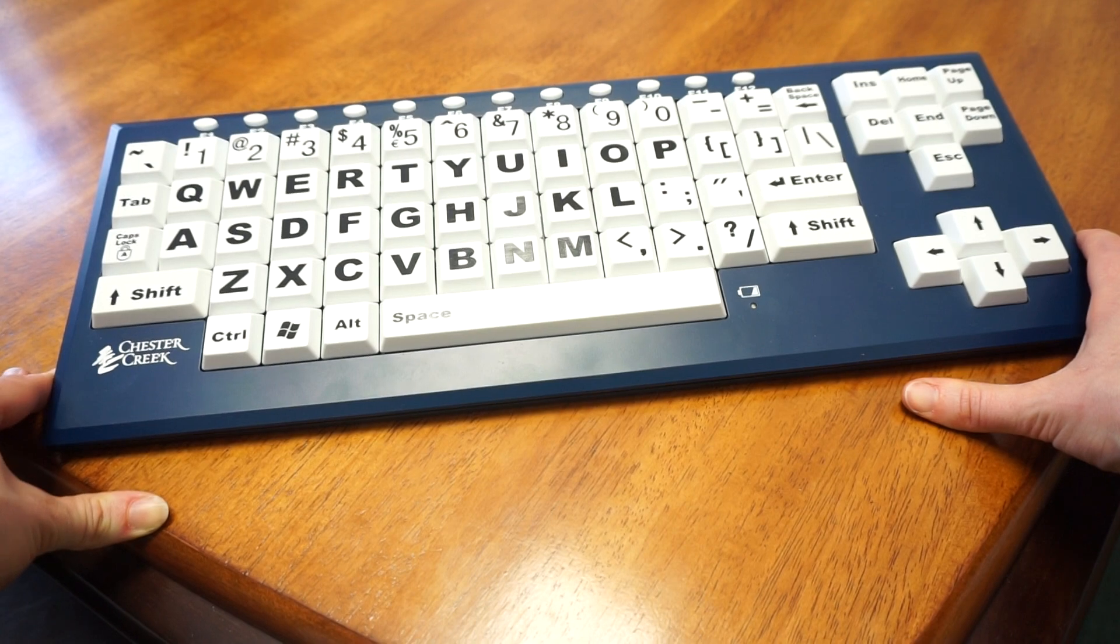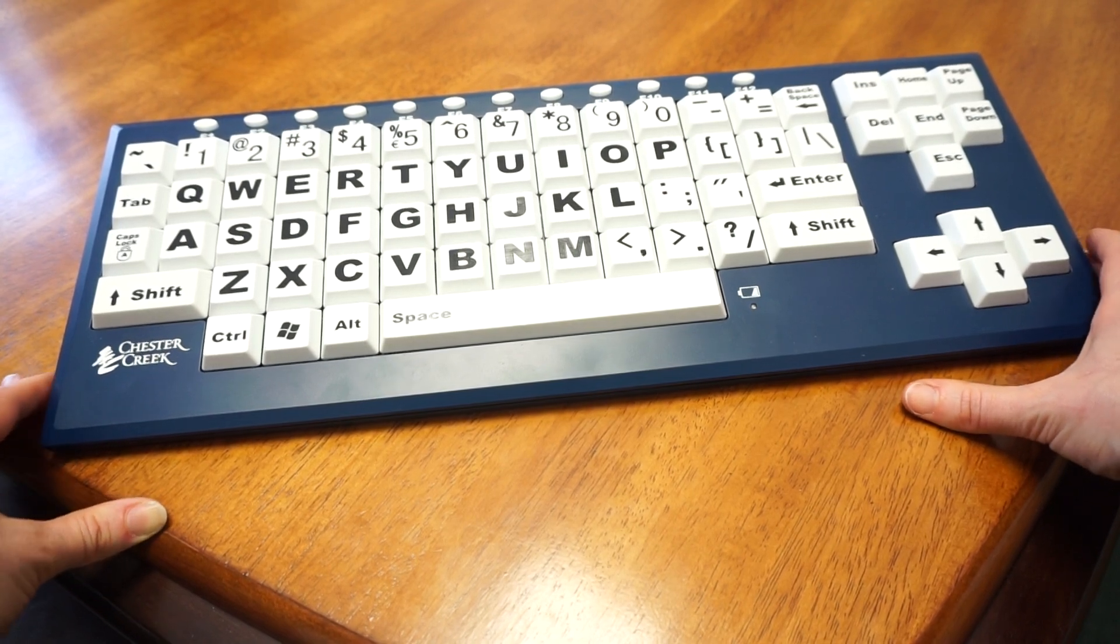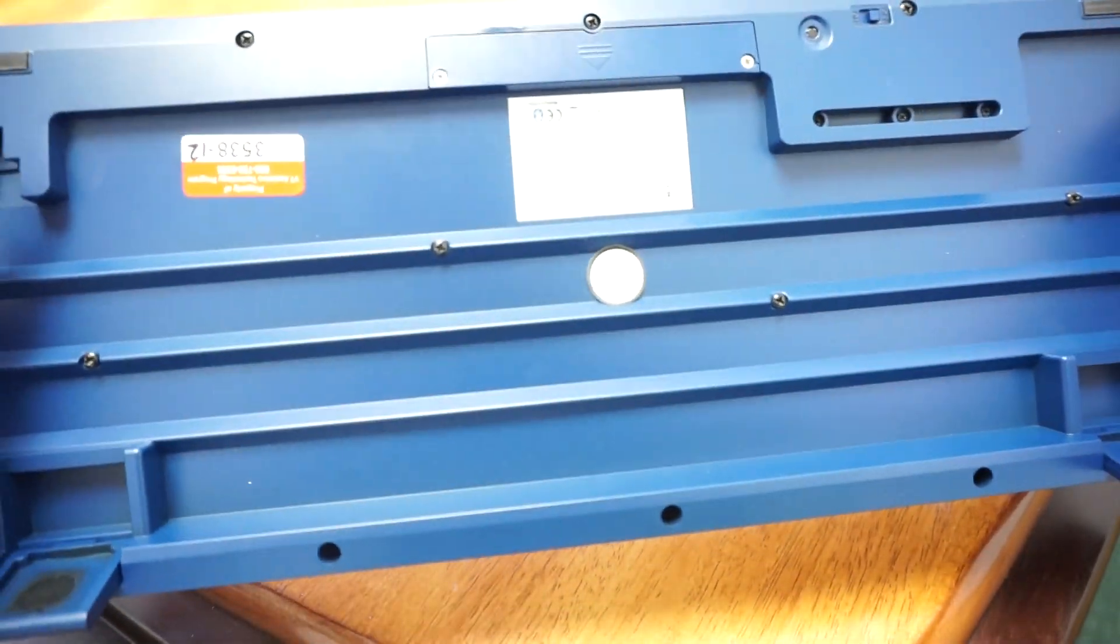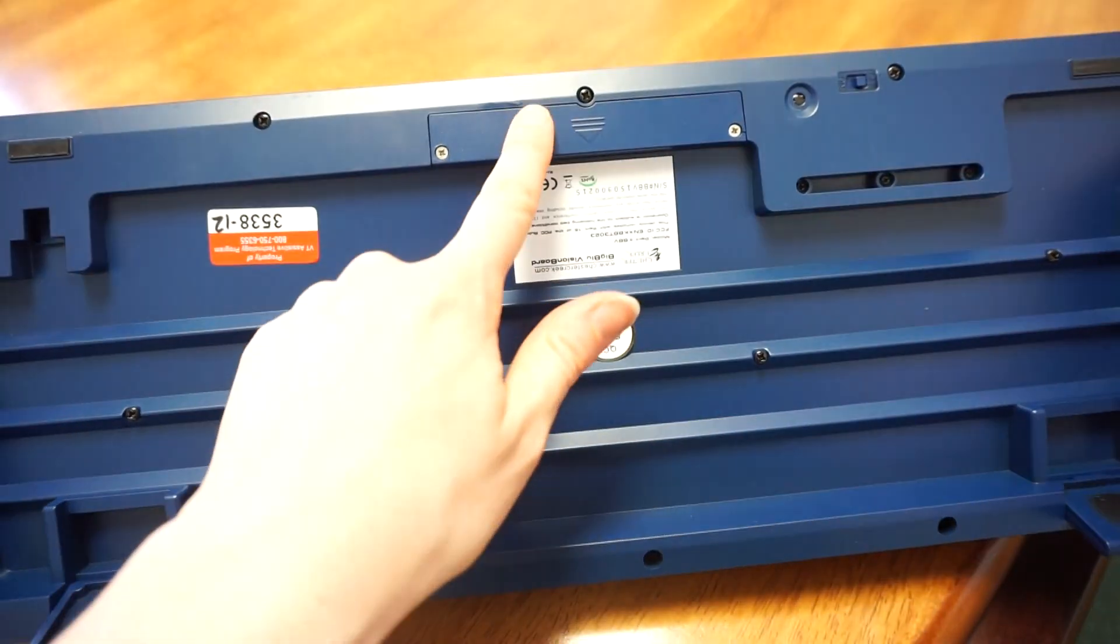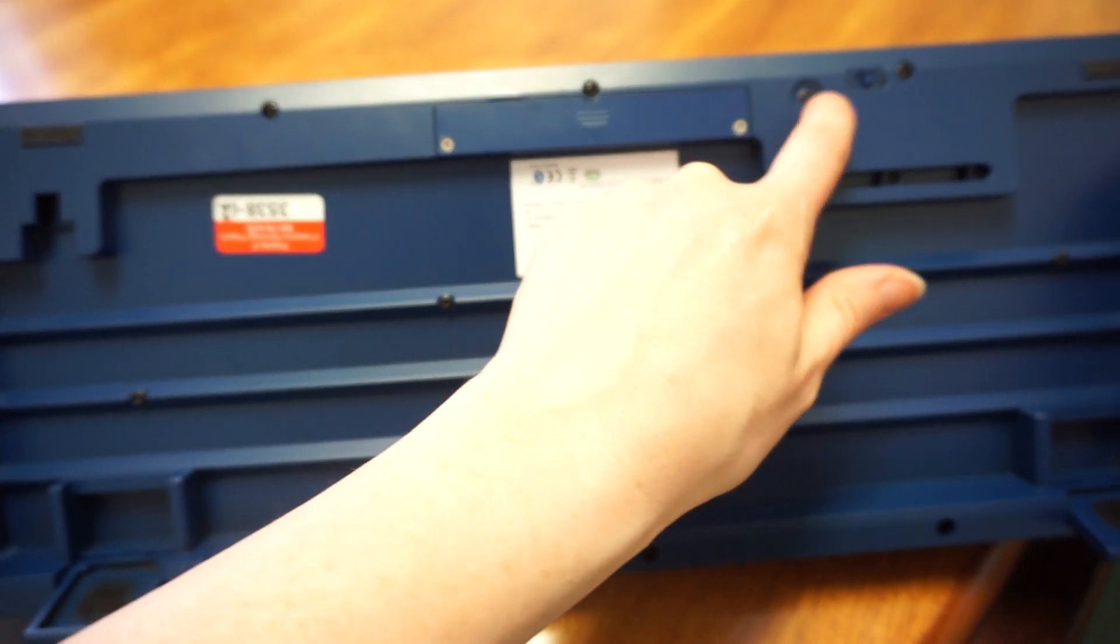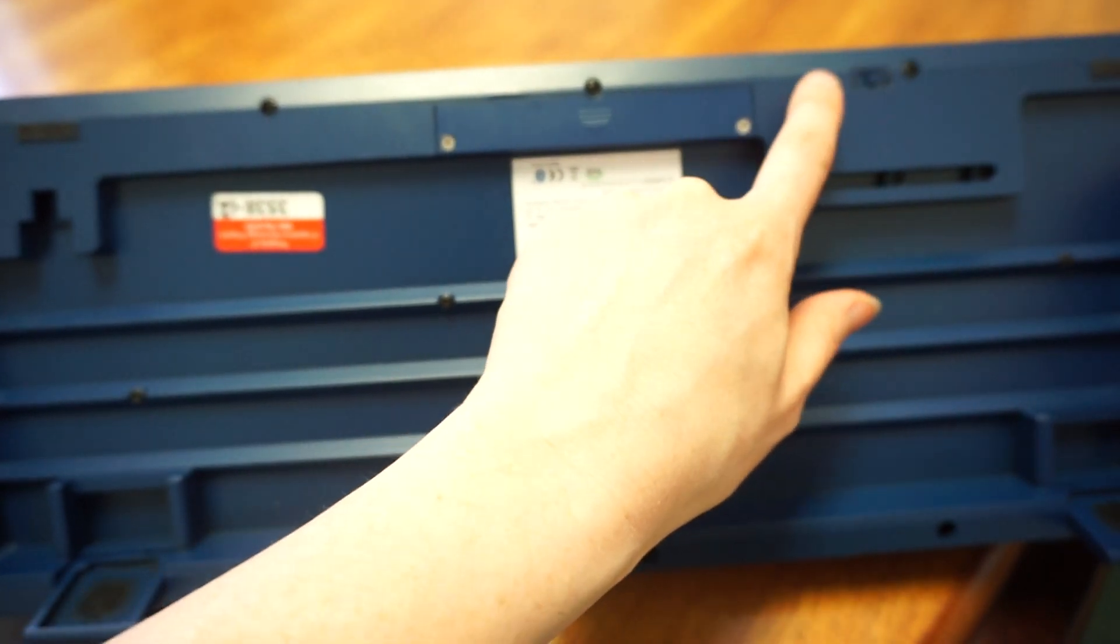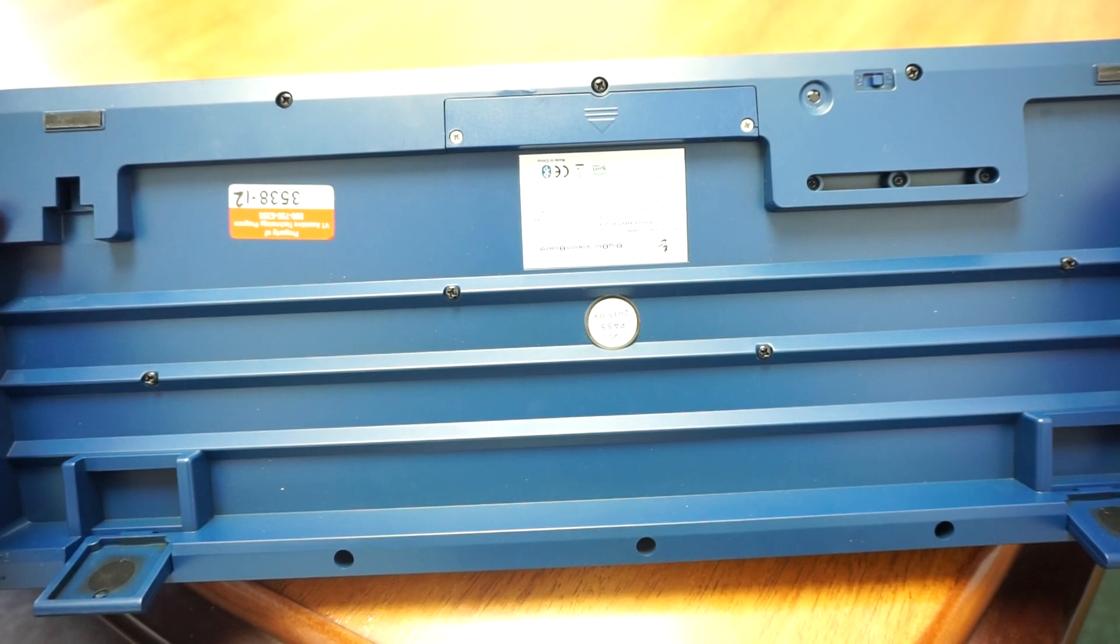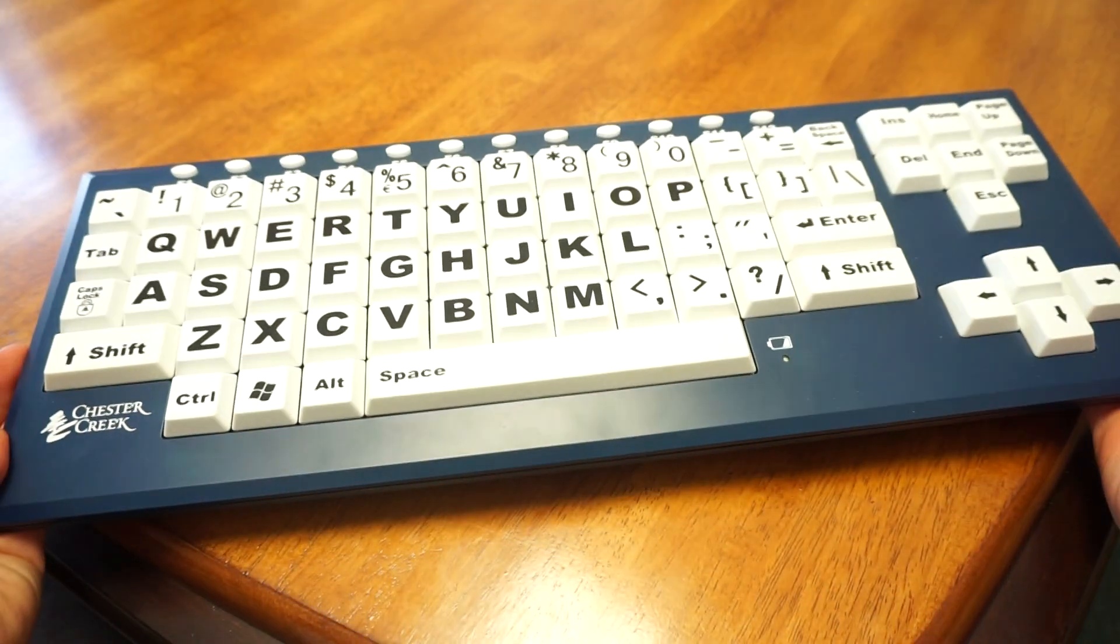This is a Bluetooth keyboard so it connects wirelessly to your computer. To do that, you look at the bottom here. Right next to the battery compartment, there's a little black button and the on-off switch. You turn it on, hold down that little black button, and that enables you to pair the keyboard to the computer.